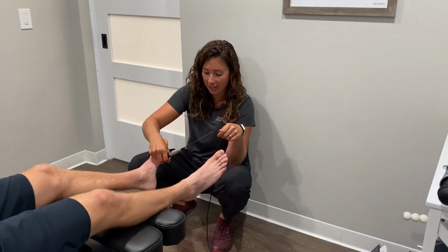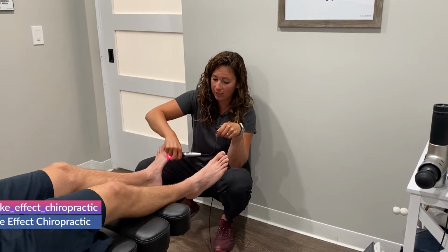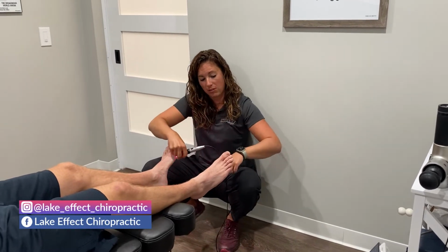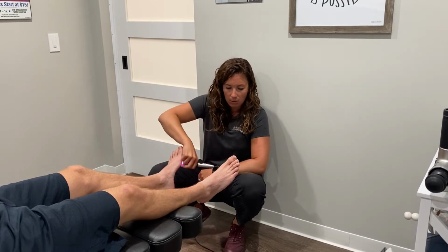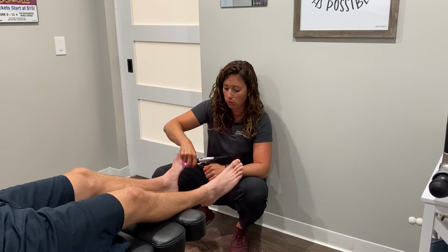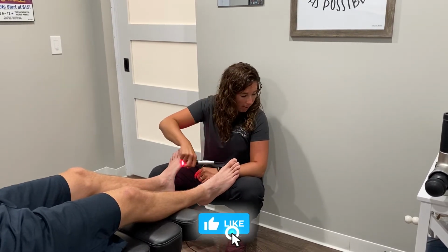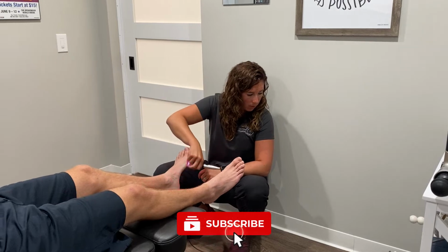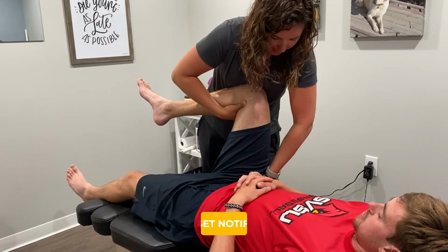All right, so we've got the laser going on Parker's feet here. He's got bones in his feet that get real sensitive under the big toe, so this helps calm him down. We've also been working with his hip and his low back, as usual. He plays baseball, so keep him running. Just about finished here, and we will jump up and do some active release on his hip.